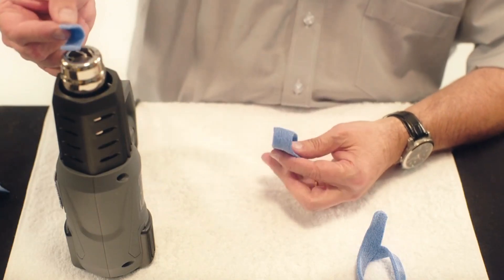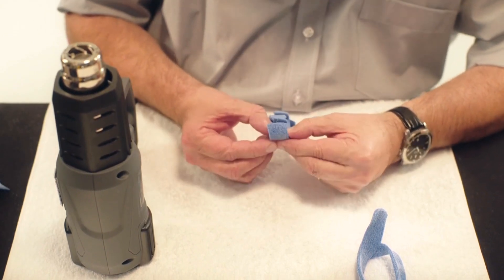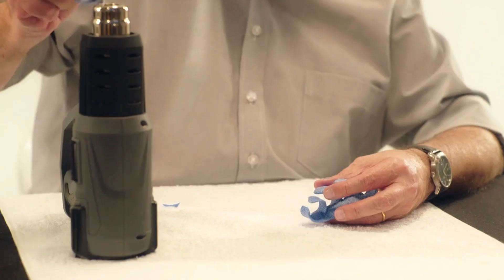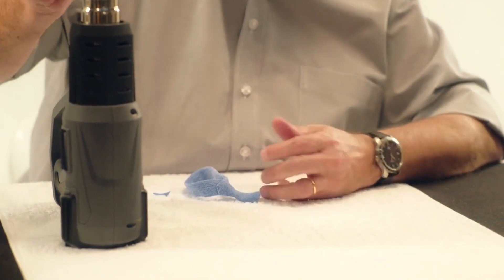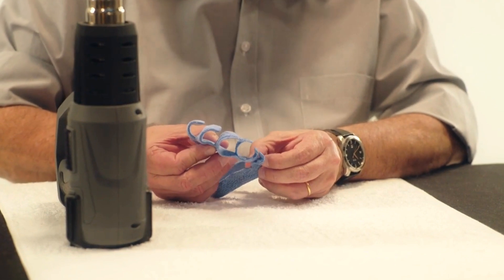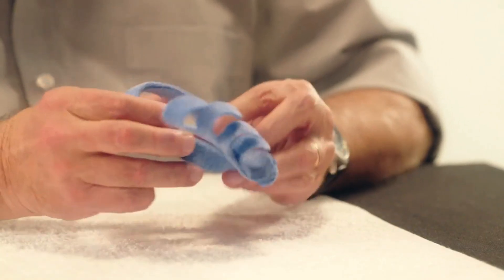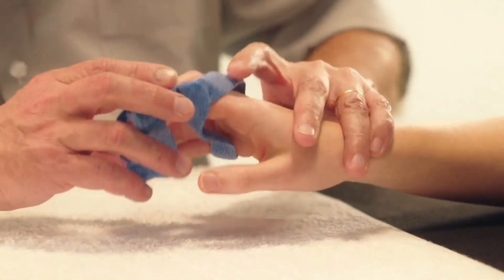Heat the second and third parts accordingly with a heat gun and stick them together. Assemble the two remaining parts by heating each with the heat gun and by firmly sticking them together. Fit the orthosis to the patient and check the alignment of the fingers.